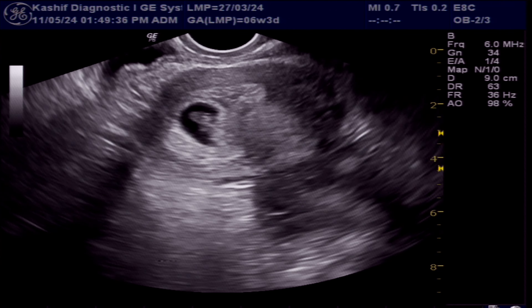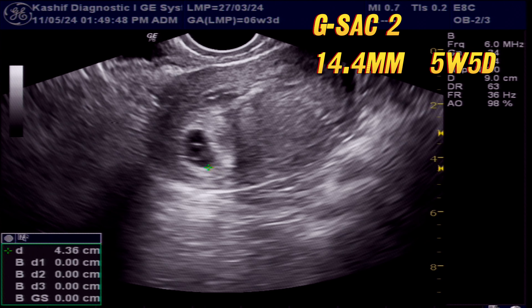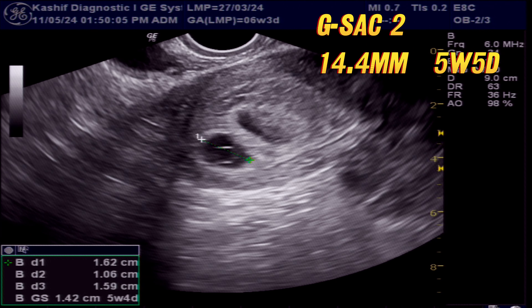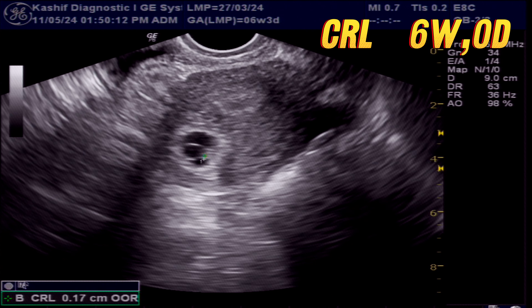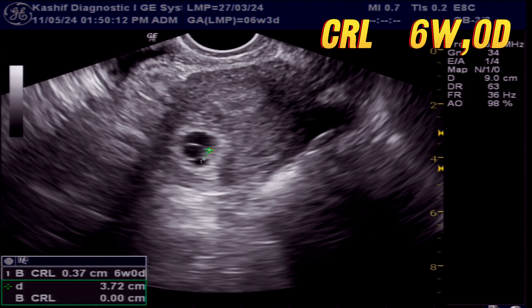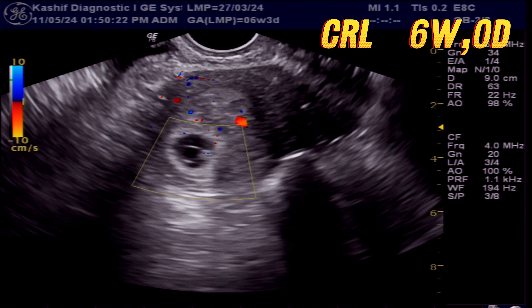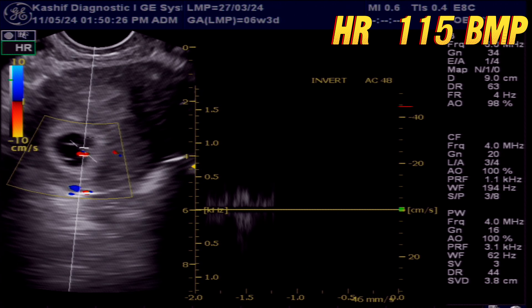This is the second gestational sac. The mean sac diameter is 14.4 mm and gestational age is 5 weeks and 5 days. This also contains a small alive fetal pole. According to CRL, the gestational age is 6 weeks and 0 days. Heart rate is 115 beats per minute.